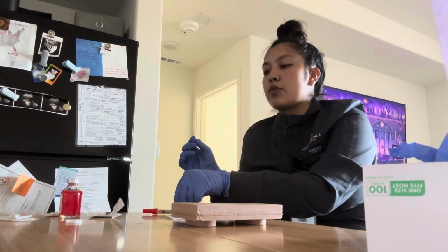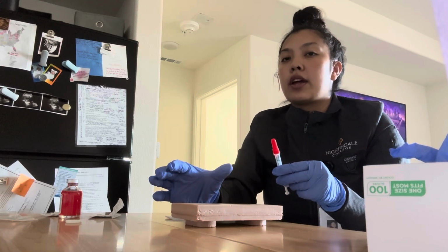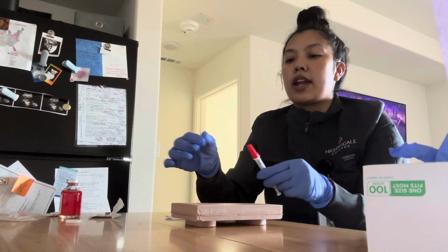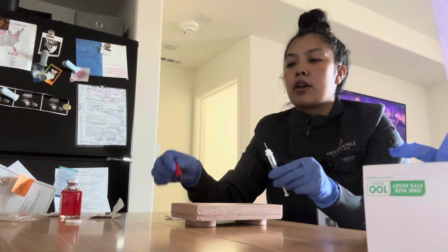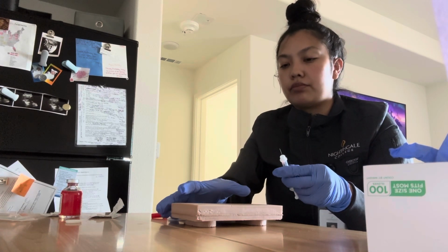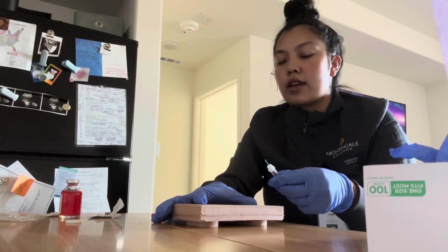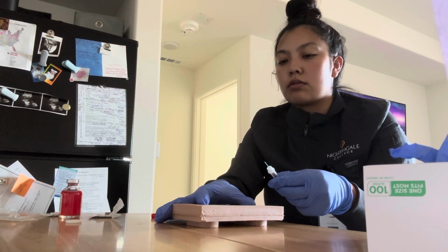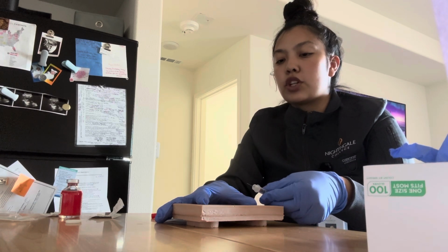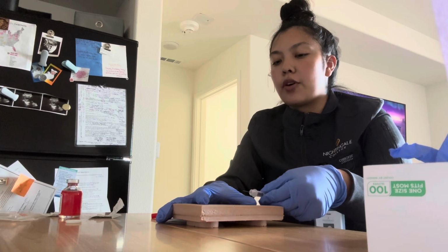Okay, remember you will feel a slight burning. Just go ahead and let me know how your day has been. And for this, I'm going to go ahead and take off the cap. And I'm also going to hold her skin taut. And then I'm going to make sure I hold the needle at a 5 to 15 degree angle.